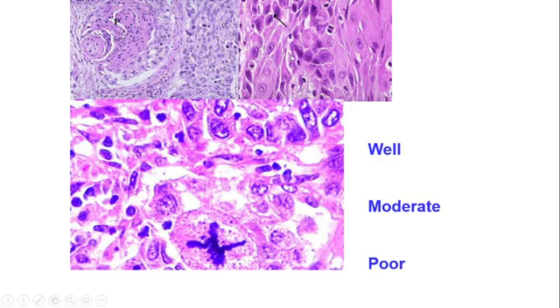Active mitosis and pleomorphism are other features of malignancy, whereas in the poorly differentiated tumor, the cells lose their features of differentiation, including keratin pearl production, and intercellular bridges or desmosomes are lost. Here, with frank or severe atypia, pleomorphism, hyperchromasia, and coarsely clumped chromatin, a very important feature of malignancy is atypical or aberrant mitosis.